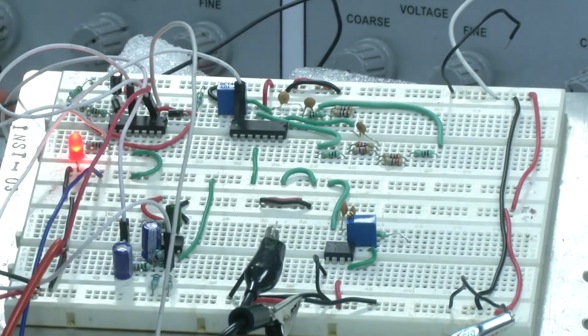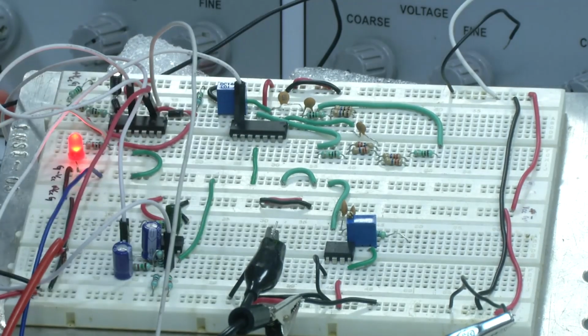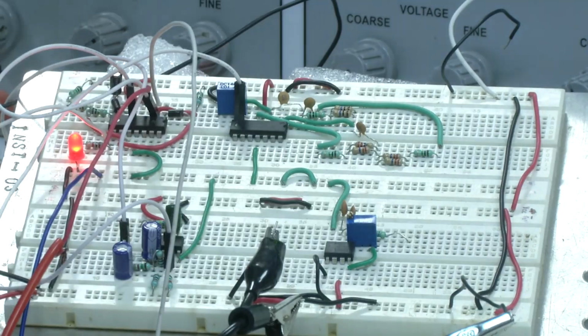And which is the output in this case? The output is after the diode. When you recall the circuit, the output is the cathode terminal of the diode, right. So the cathode terminal of the diode is connected to the second pin. The second pin is nothing but the inverting terminal of our op amp.